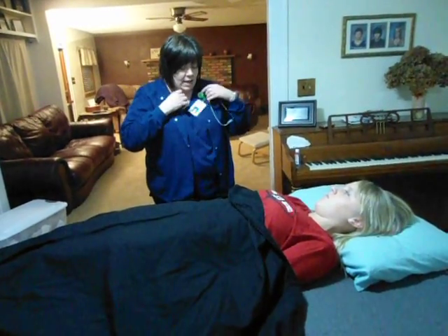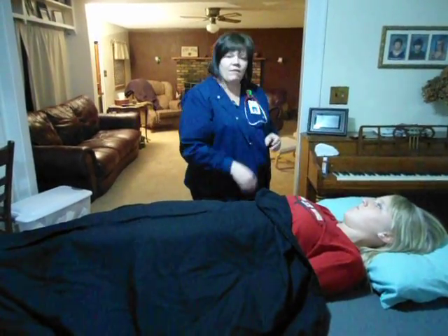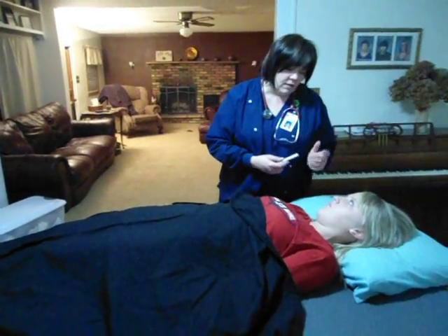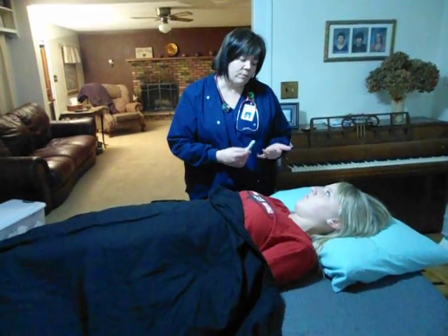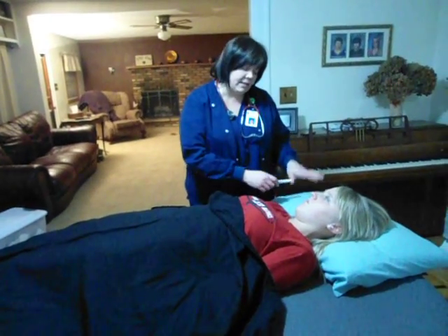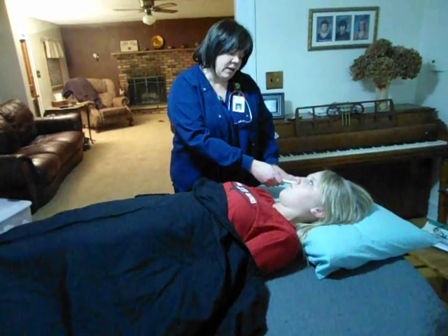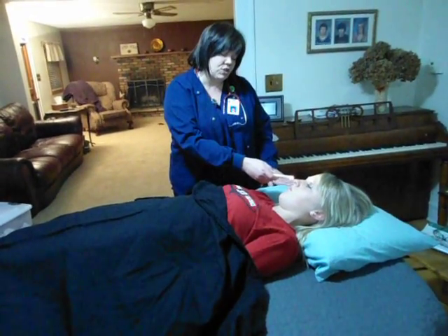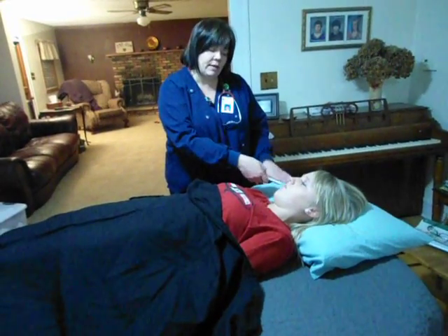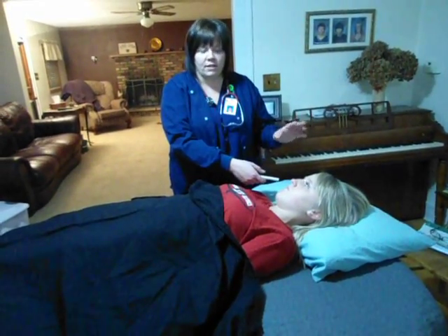Then I'm going to dim the lights in the room so I can do her neurological assessment. I've already asked a few orientation questions of the patient, and so I've already determined that she does know the date, the time, who's the president, all that kind of stuff. Then with the lights dimmed, I'm going to get my pen light on and watch for constriction of the pupil. And then I'm going to do it again and watch for constriction of both pupils. I want to make sure that there's a consensual reaction.